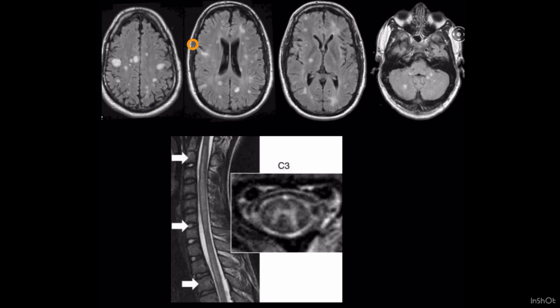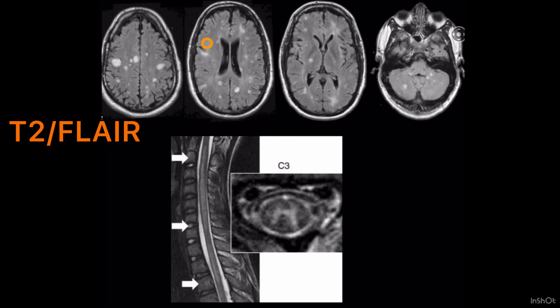The other salient features we see in ADEM are in the brain. We will see multiple extensive T2 hyperintensities scattered throughout the white matter — even bilateral thalami, brainstem, and bilateral cerebellum. These areas will also be involved.